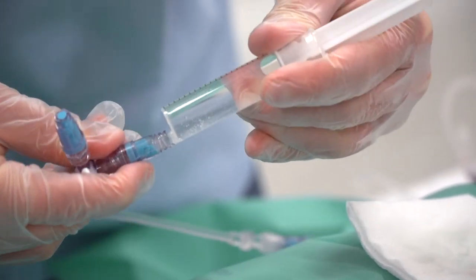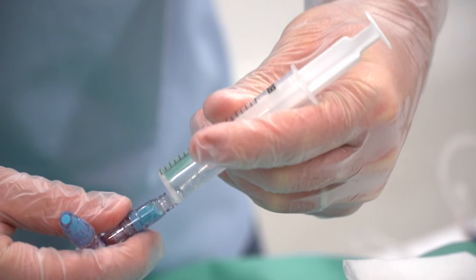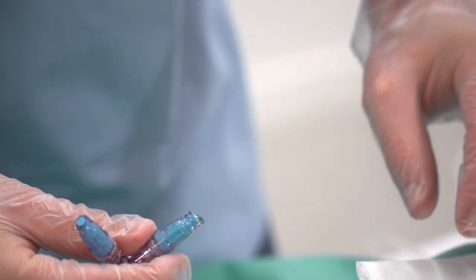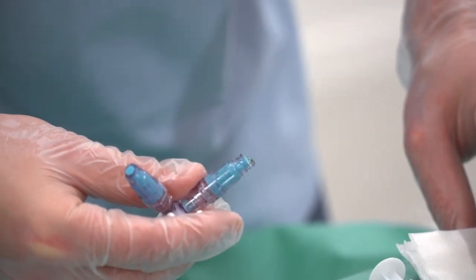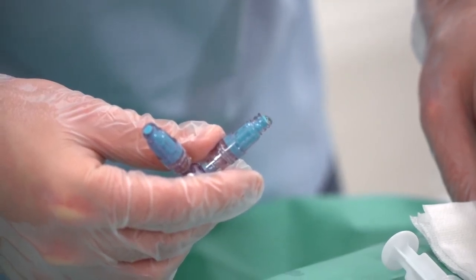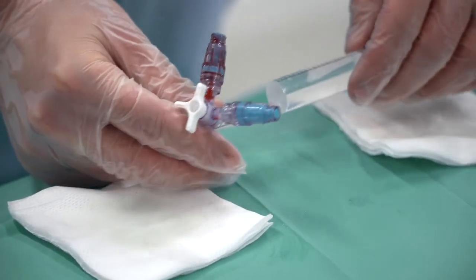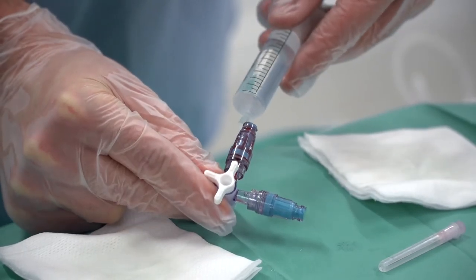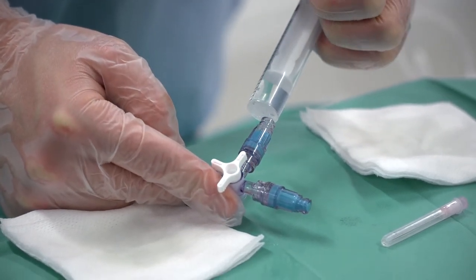When the connector is dry, connect the syringe directly to the connector and inject. After injection or infusion, unscrew the device but do not remove the connector. Leave the proximal valve in place even if the line is not perfused. In case of macroscopic contamination, after disinfection and when the connector is dry, rinse the connector with saline.